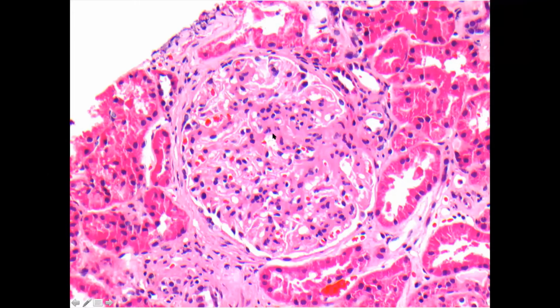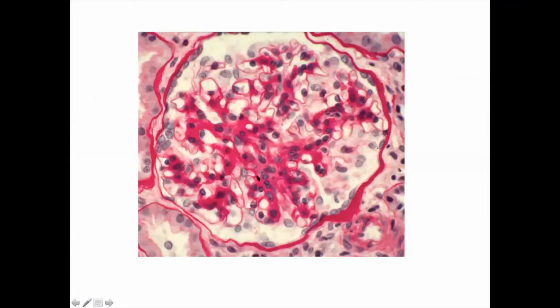إنزين نروح على ال higher magnification نشوف إن عندنا شوية red blood casts, and although this is H&E بس كأننا نشوف إن there is a little bit of mesangial expansion هني, and there is mesangial hypercellularity. Okay, there is mesangial hypercellularity, especially in this area over here, شوية over here بعد. And this is our PAS. And هذا يعني يبين إلينا بما لا يترك مجال إلى الشك إن yes, we do have mesangial hypercellularity.